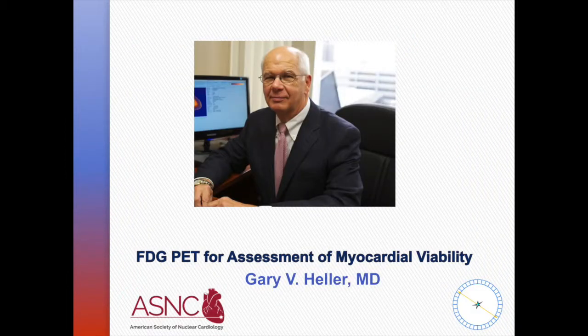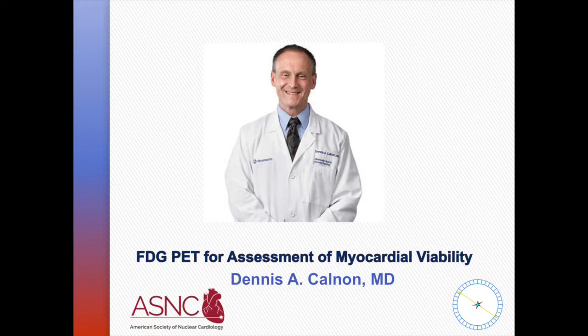So Dennis, in your laboratory, it sounds like if somebody calls you up and wants to do an FDG viability study, you would move them in the direction of assessing for ischemia first, followed by an FDG study after that. Is that correct? Absolutely, and I think that's very important. And if you look at the ASNC guidelines for PET imaging with FDG, they also support this kind of approach.